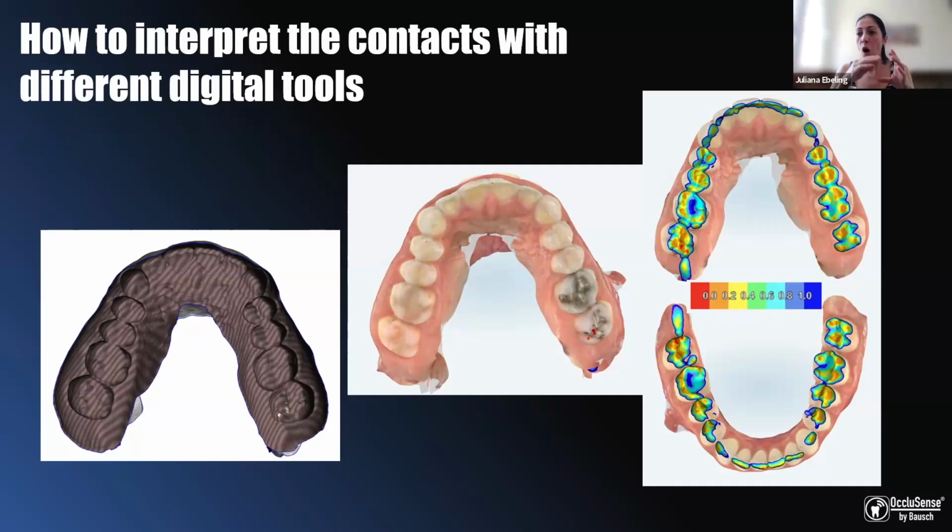It's a picture from a moment of this movement. Different from papers that put all this movement in the same picture. It's like adding all these pictures and then I have a final picture. Here I have a picture from a moment from this registration, this movement.